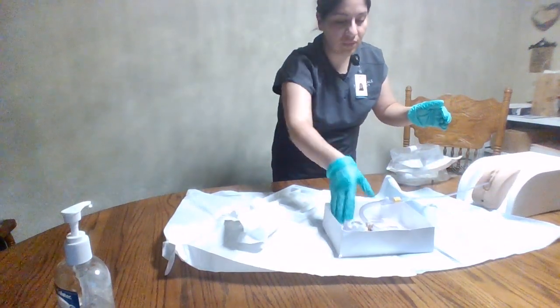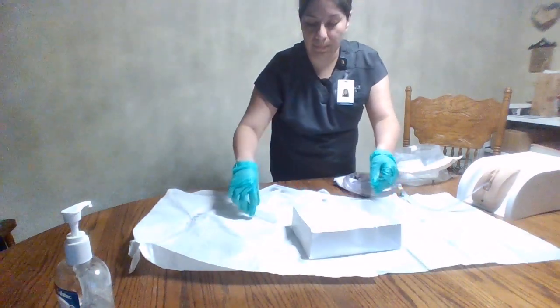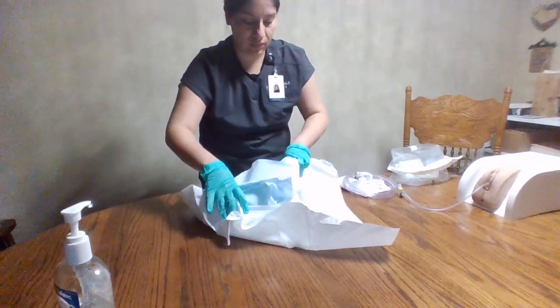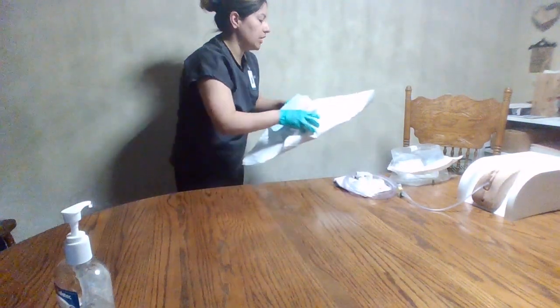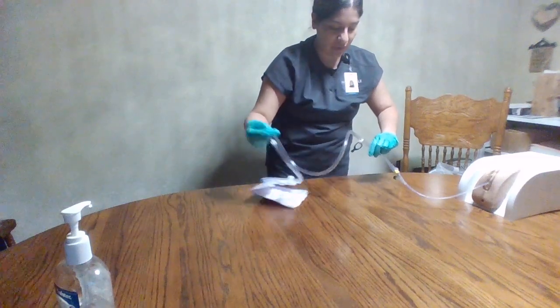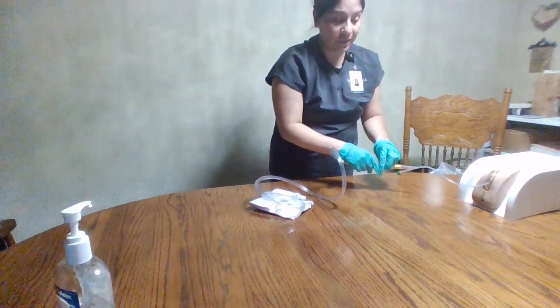And I will remove the other items as well, and dispose of all the items in the trash since they're no longer needed. And then with the catheter, I will secure the catheter to the inside of the patient's thigh using a securement device.